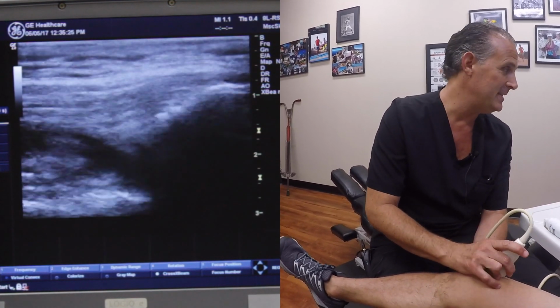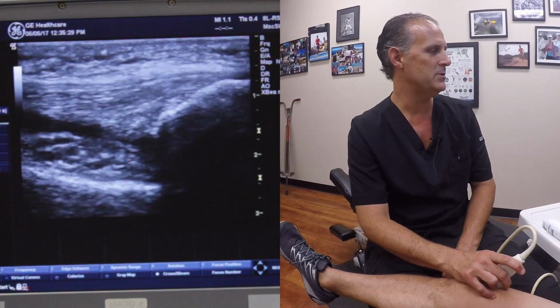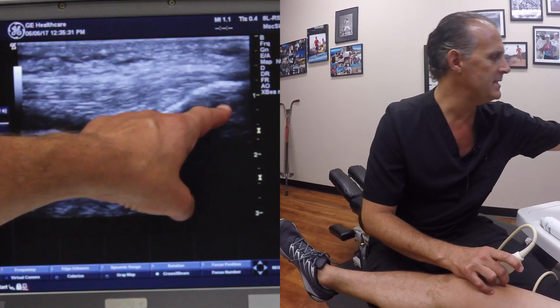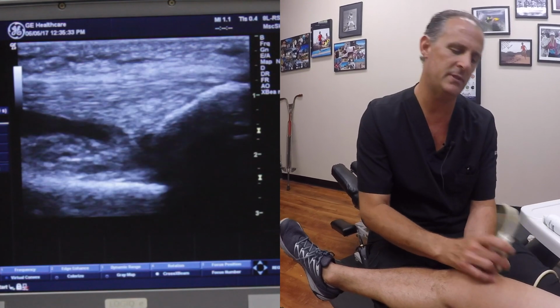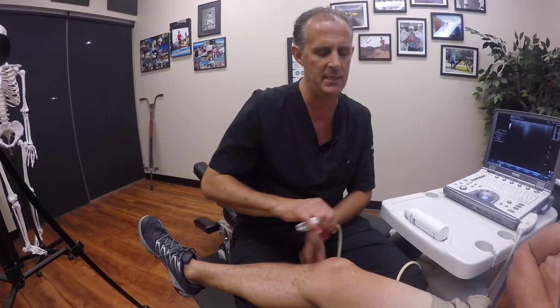The quadriceps tendon looks good. It kind of comes across here and attaches up top. So there's no problem with that. It's a common site for bone spurs on the suprapatellar pole or the upper edge of the kneecap. That's probably the most common thing that we see in a knee.